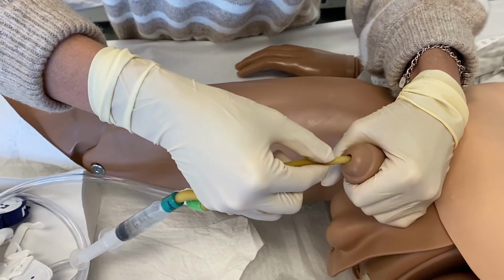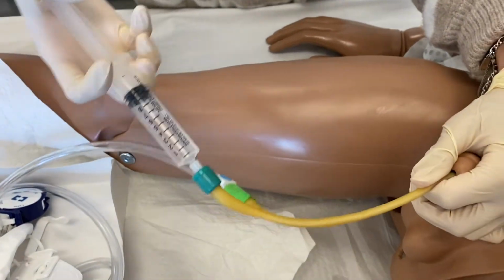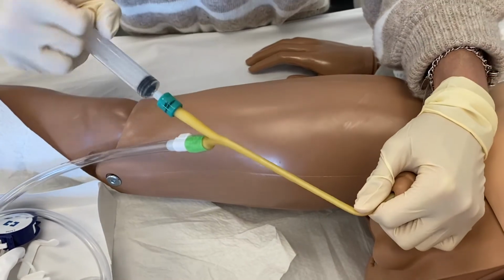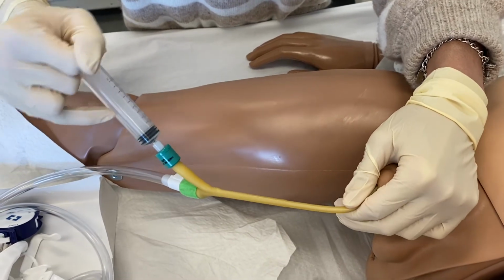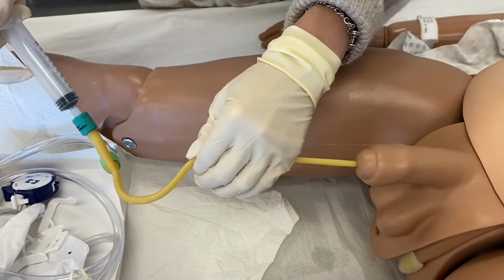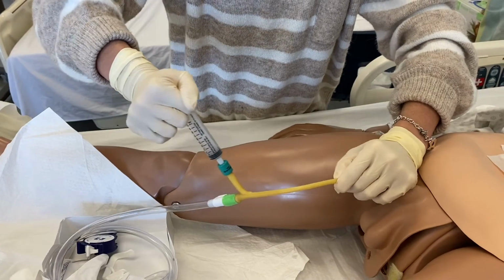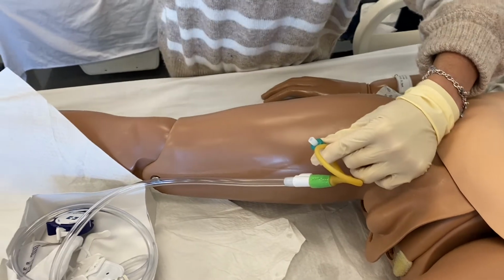Okay, so I'm going to inflate the balloon with my sterile hand. I'm going to give it a nice firm tug. Inflated the balloon, I'm going to pull this up to my dirty hand and twist it and discard.